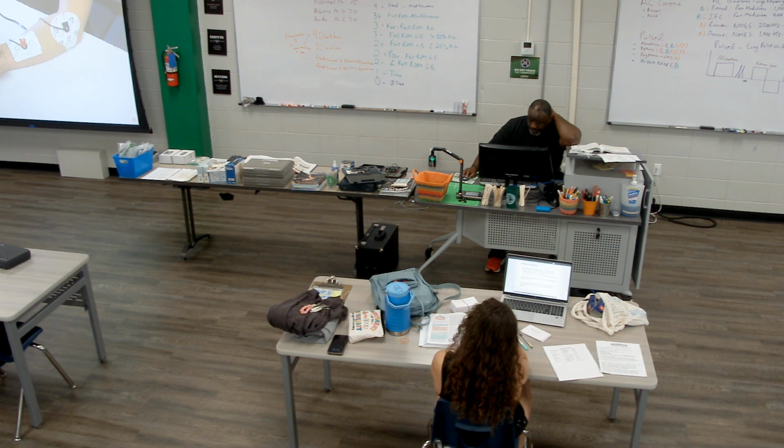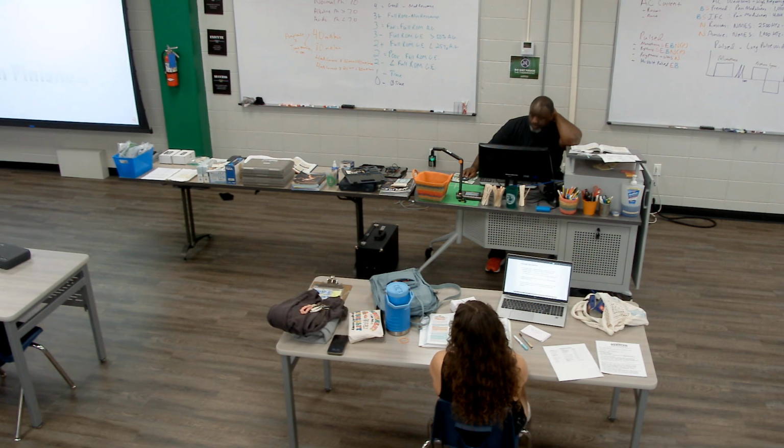When the treatment session is complete, turn off the unit, gently remove the electrodes, check the condition of the skin, and assess the patient's symptoms. Okay, so that's how you would set up iontophoresis.